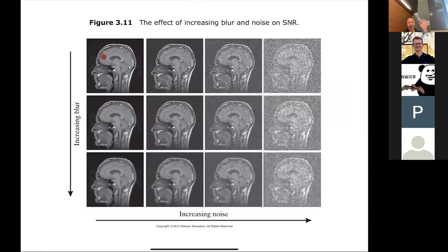Now, there's also a trade-off that I think you've seen before. If the noise is random, you can reduce it by averaging, by blurring it out. So it is possible to reduce the noise, but the problem is you're also reducing your resolution, right? You're smoothing things out. Okay. So that's also not necessarily a great solution, although sometimes it's the best you can do.